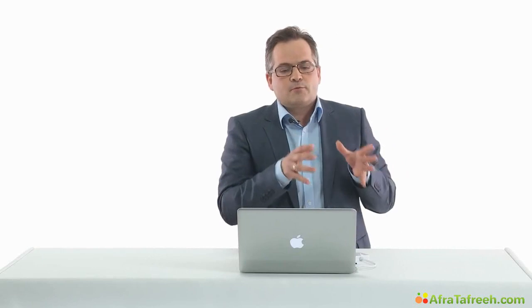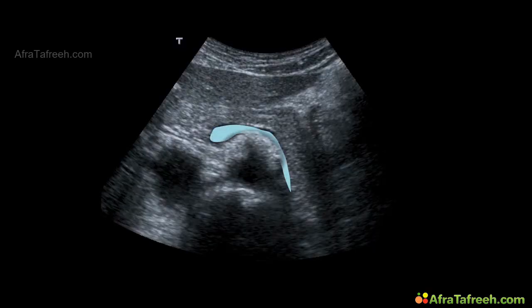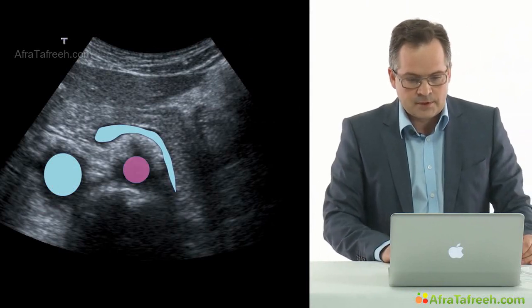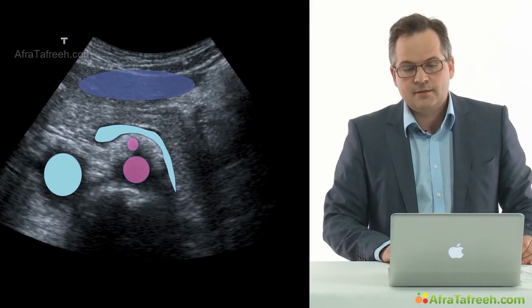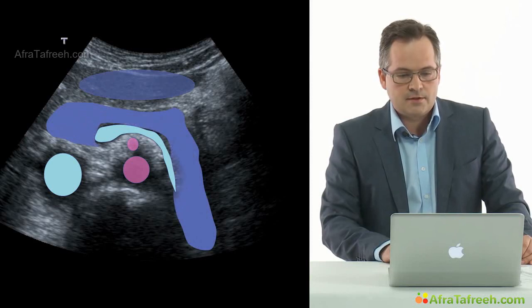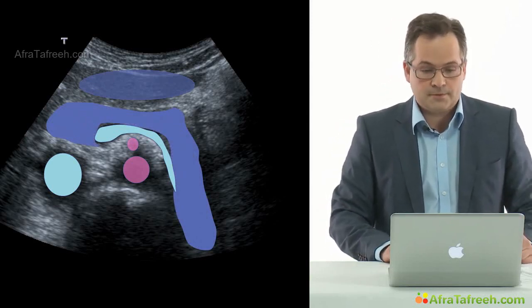With this information from MRI, I went to the ultrasound machine and tried it once more. Now, on the screen of our ultrasound machine, we first identify the guiding vessel, the splenic vein. There it is. We see the IVC, the abdominal aorta, and the superior mesenteric artery over here. And then we can see the left liver lobe, used as an acoustic window in this case. And that's the pancreas. Very clearly seen when you know what to look for.